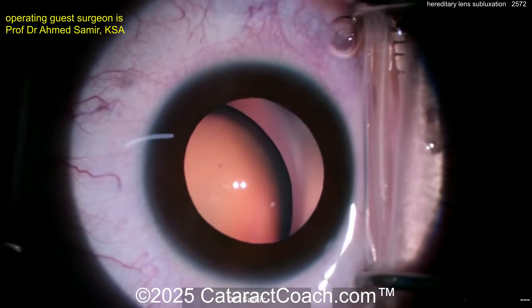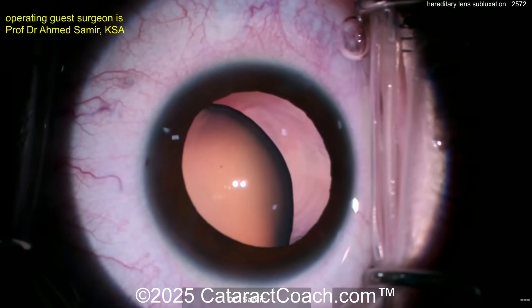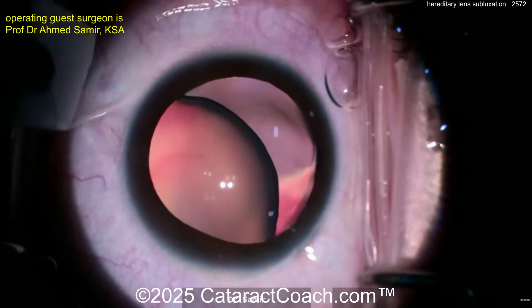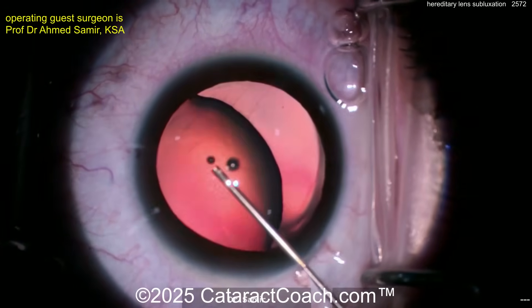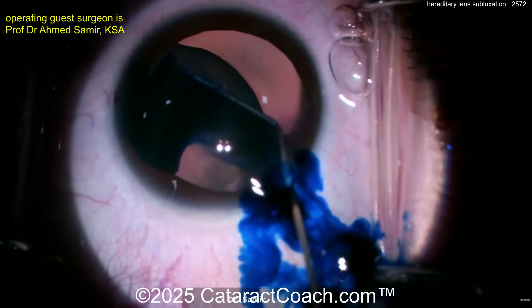Starting off with a pair of iris hooks, and another pair is there as well. It looks like probably some anesthetic, maybe some epinephrine or phenylephrine. Making an incision — nice, hitting the limbal vessels. Some viscoelastic to tamponade that one area, and now taking out the bubbles.